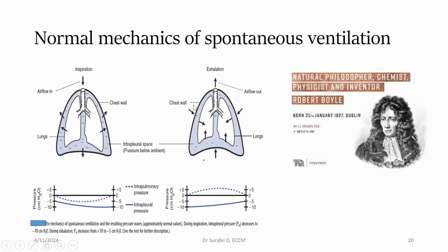But this varies when you apply positive pressure by the use of a mechanical ventilator to drive gas flow into the chest. There should be a pressure difference between the intrathoracic cavity and the outside atmospheric pressure in the case of a spontaneously breathing patient, or a driving pressure in the ventilated patient, so that the air will go into the chest. So that's what we call positive pressure ventilation.